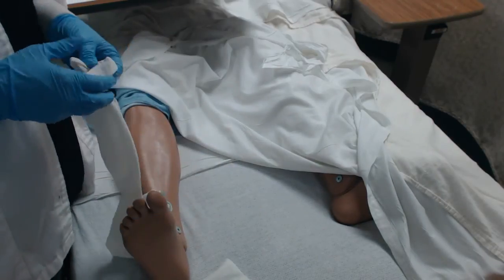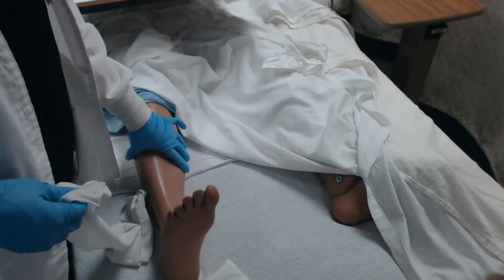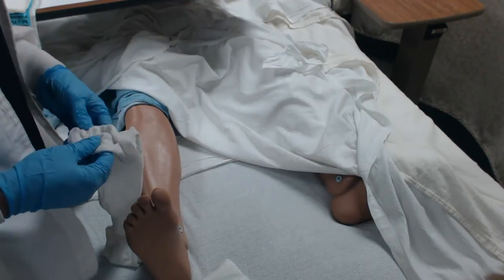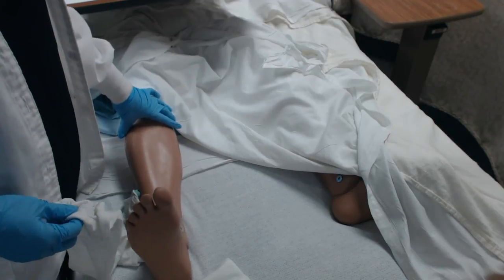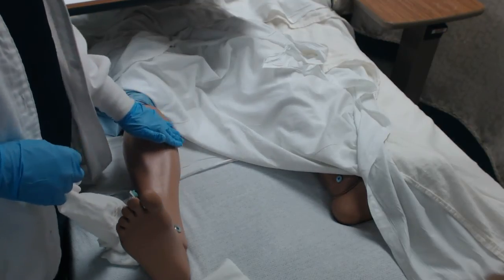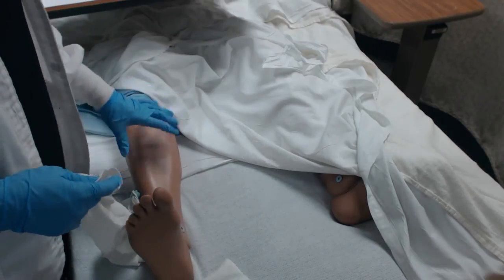You don't want to have this stocking bunched up at the top. Remember, if we're using this for edema or swelling of the leg, we don't want it pinching into the skin. So it will make marks in the skin, and then we have skin integrity issues. So we want to make sure it is nice and smooth on the skin, that there's no wrinkles or rippling that can cause skin integrity issues.